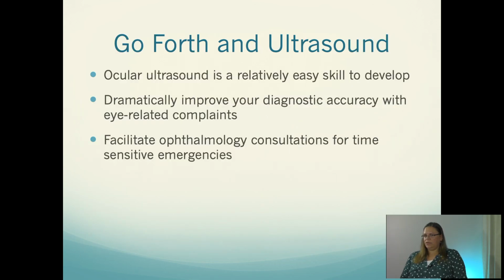All right. So go forth and ultrasound. Ocular ultrasound is a very easy skill to develop. Like anything else, it does take some practice, but it's one of the more technically easy studies to do. It can dramatically improve your diagnostic accuracy, especially if, like me, the fundoscopic exam is the bane of your existence, and will facilitate ophthalmology consults for time-sensitive emergencies.